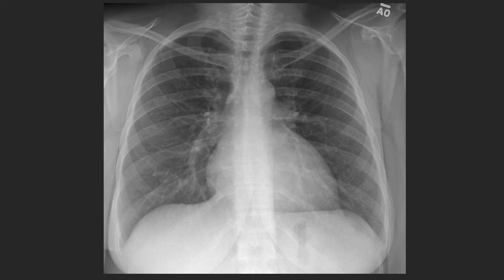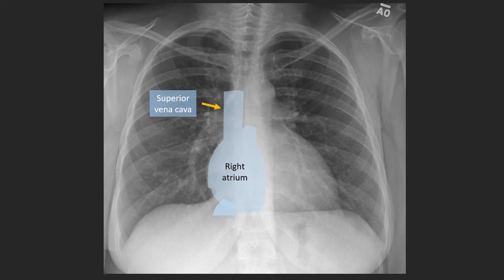To highlight the cardiovascular structures, we're going to follow blood through the heart. The first chamber where blood enters is the right atrium. Blood enters the right atrium via the SVC as well as the IVC, which is seen more inferiorly. Notice how the right atrium forms the right cardiac contour. The SVC is often vaguely seen on the frontal view whereas the IVC is typically not identified. The tricuspid valve, seen here in purple, has a midline location largely overlying the spine and is typically not visible unless surgically repaired.